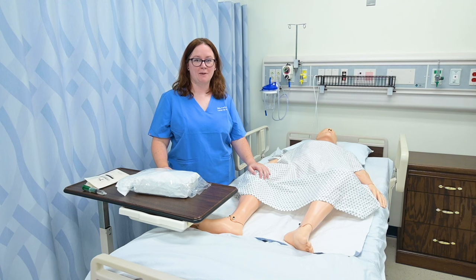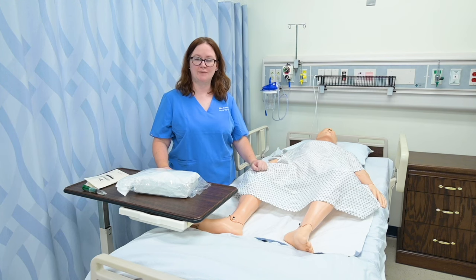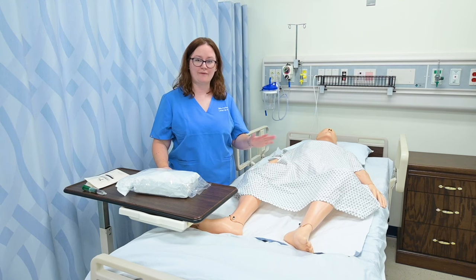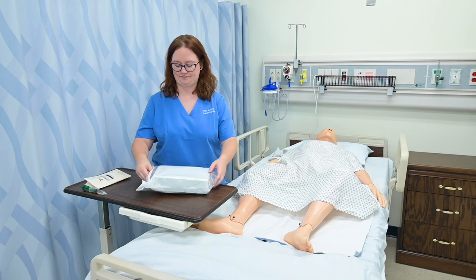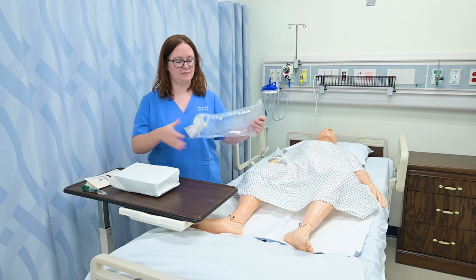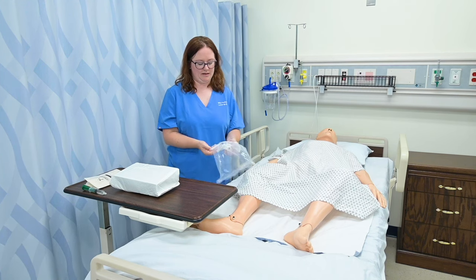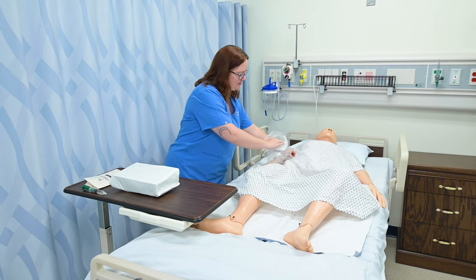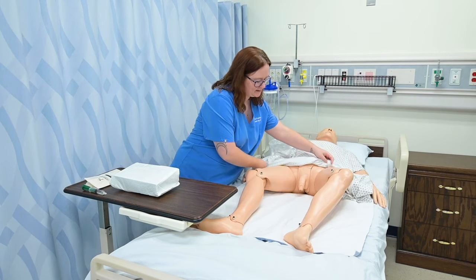To insert an indwelling catheter on a patient who is male, we want to have already positioned them in a supine position and done any perineal care that's necessary — I've already done that here. So I'm going to go ahead and open my kit. I'm going to take this bag and roll it down a bit in case I need a trash bag, and I like to place it up here. I'm going to go ahead and expose him while I'm setting up my sterile tray.